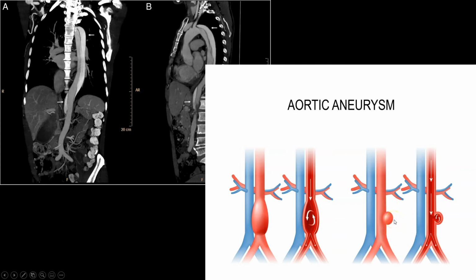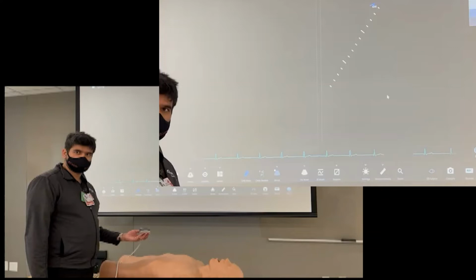Now, luckily, saccular aneurysms are very uncommon, but that being said, for fusiform aneurysms, we can easily find these on ultrasound most of the time. Saccular aneurysms are much harder to rule out. So if your probability is high, you may need more imaging there as well. Okay. Now let's talk about how to do it.